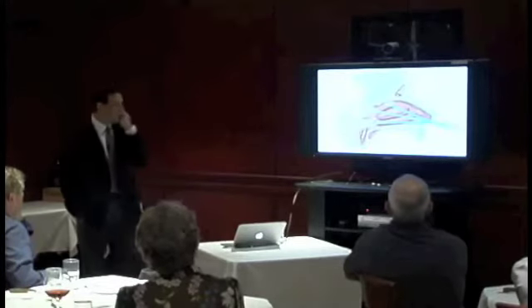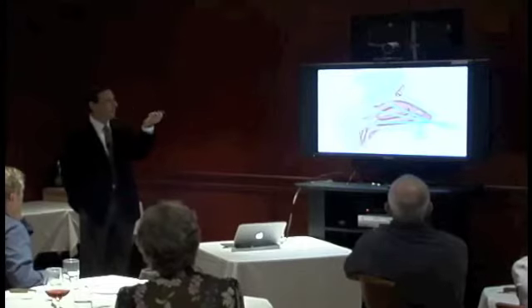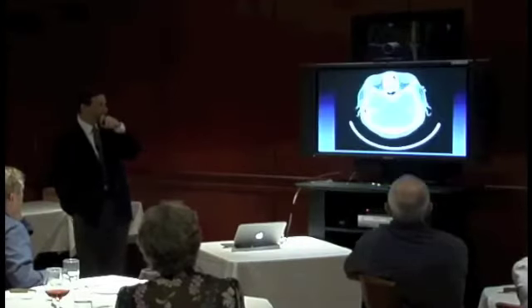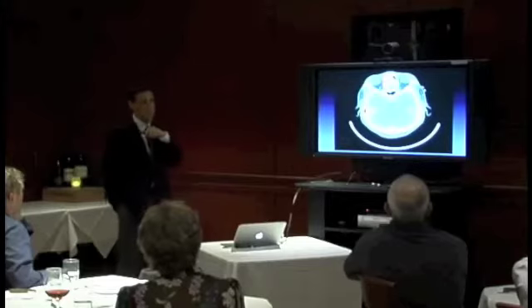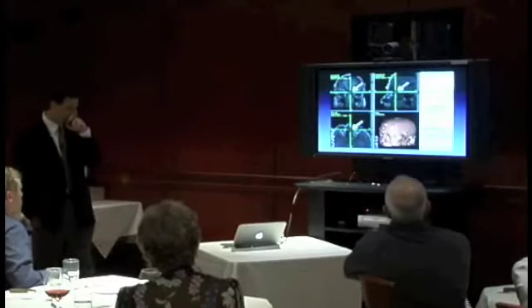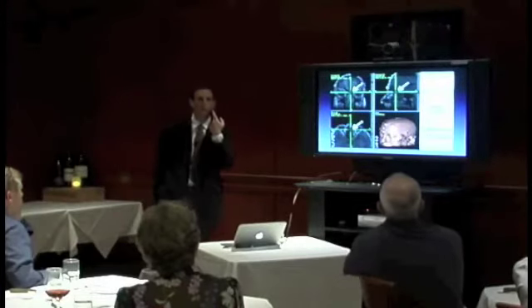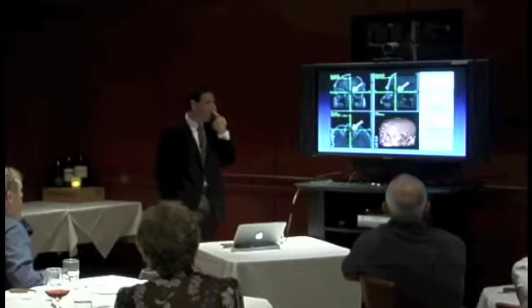So just to give you a couple of examples of what we've been able to do in the past 5 to 7 years with this, we're going to start in the top and we're going to work our way to the bottom. This is a patient with a frontal sinus mass. Presented with headaches and spinal fluid leak. We basically use an expanded endonasal approach to get up to the frontal sinus and the anterior ethmoids.